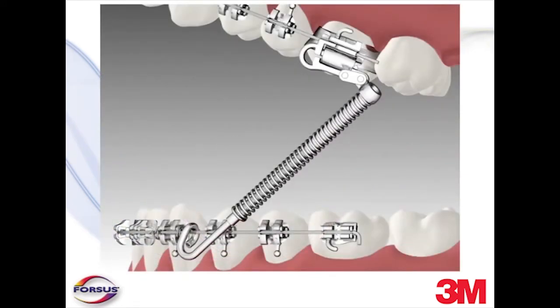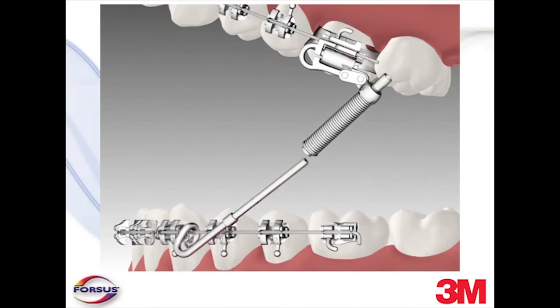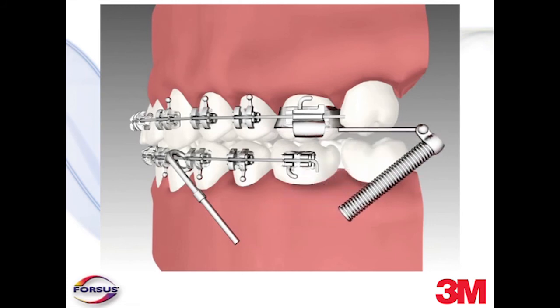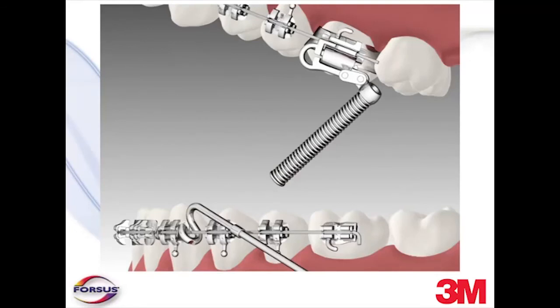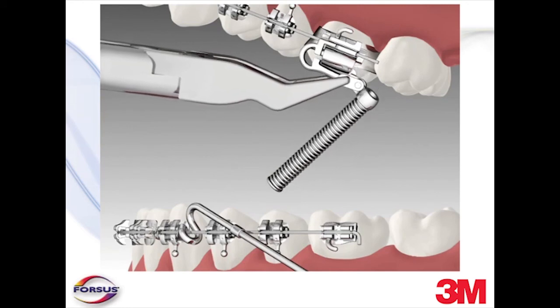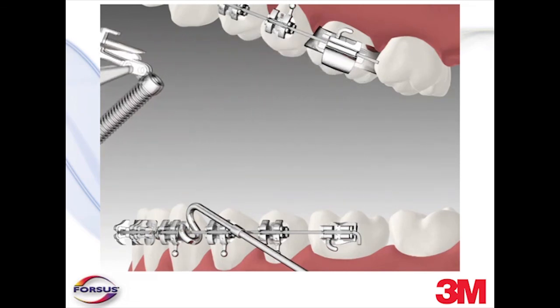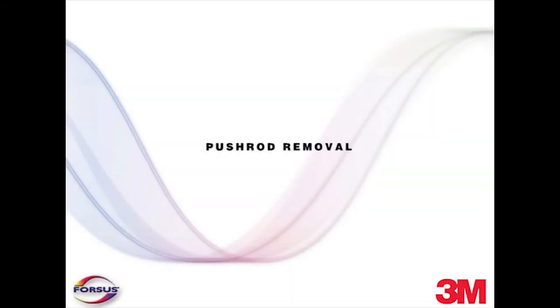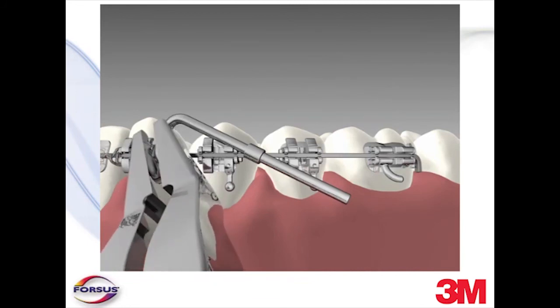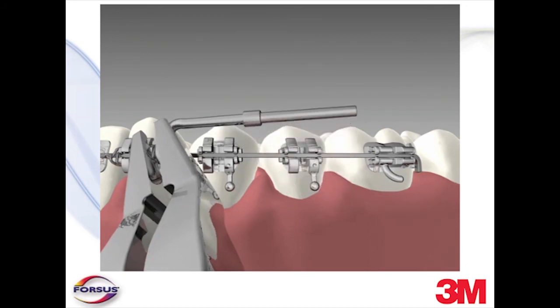To remove the device, first with the patient's mouth wide open, compress the spring and remove the spring assembly from the pushrod. Then, for the L-PIN module, bend the L-PIN straight and pull it out of the headgear tube distally. For the EZ2 module, with Weingart pliers, grip the distal end of the EZ2 module clip and pull the EZ2 module in an occlusal mesial direction, opening the clip and pulling it out of the headgear tube. Finally, grasp the distal end of the pushrod with your fingers, holding the mesial loop in place with your Weingart pliers. Bend the pushrod to open the mesial loop and remove it from the arch wire.